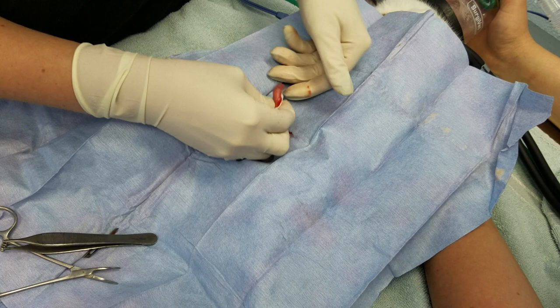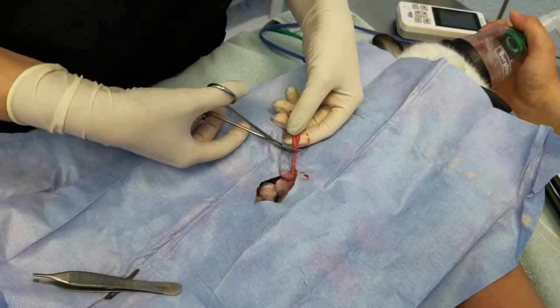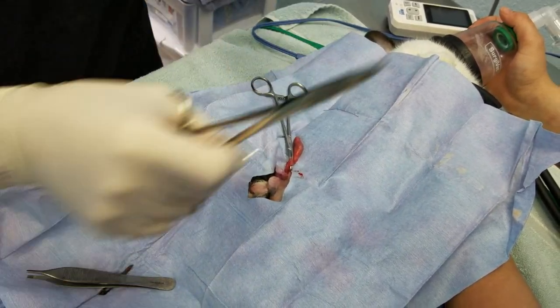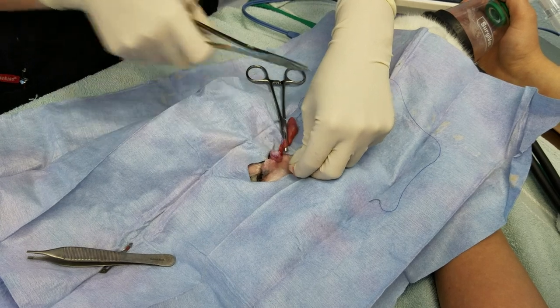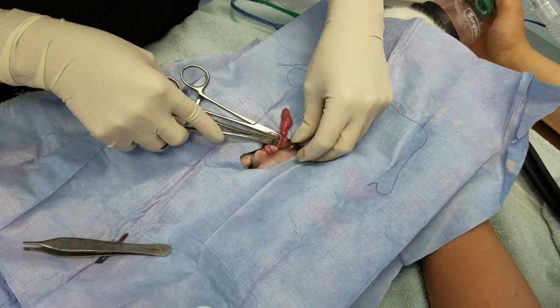Strip it down. And these guys do tend to have thicker pedicles than cats and dogs that we're used to dealing with. So you don't want to overstrip it. And then we're going to do another modified Miller's.